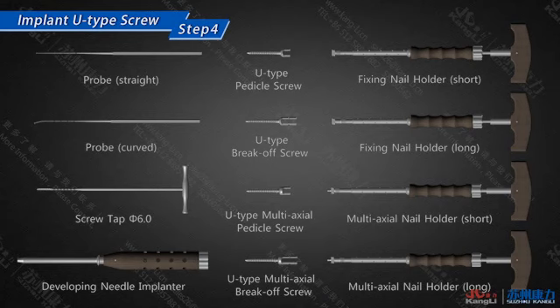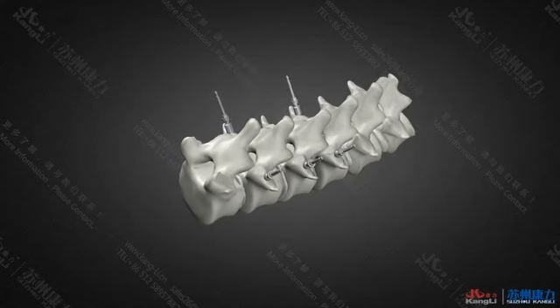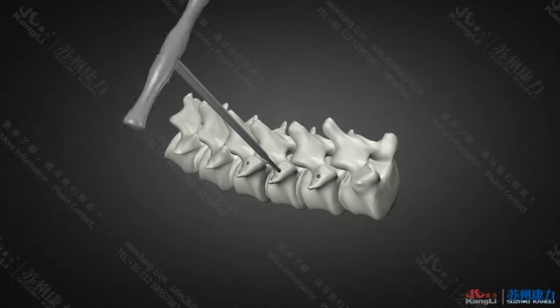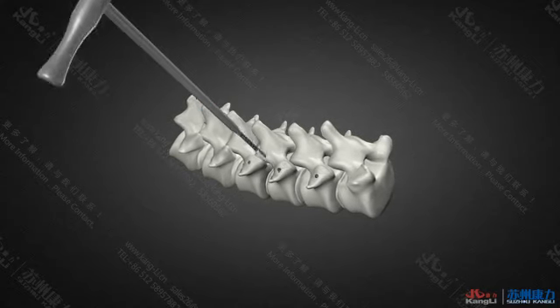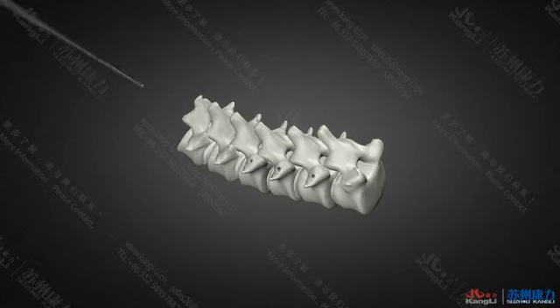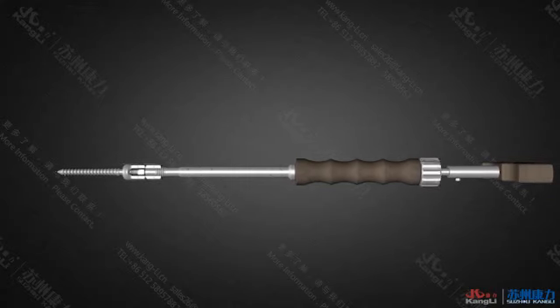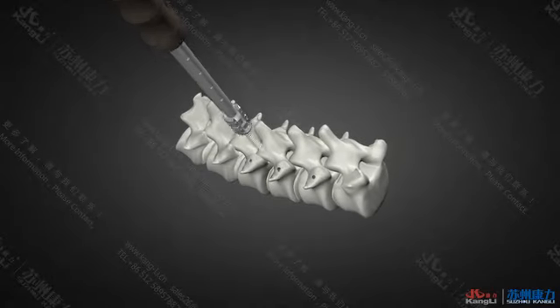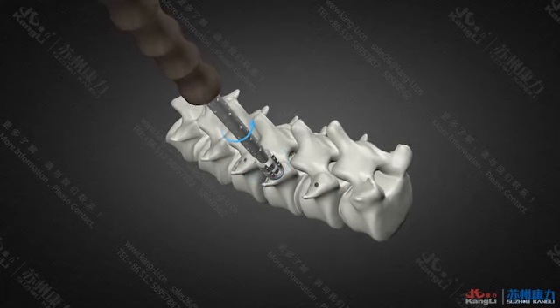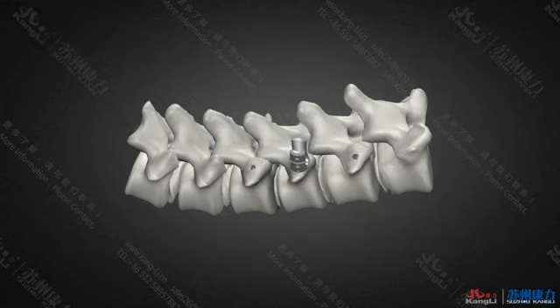Step 4. Implant U-type screw. Remove the developing needle. Then drill in with the matched screw tap to a proper depth. After that, remove the screw tap. Use the nail holder to install the multiaxial pedicle screw. Wrench through the implantation hole clockwise with proper speed and angle. After implantation, remove the nail holder. Repeat the above to install the U-type pedicle screw and U-type break off screw.